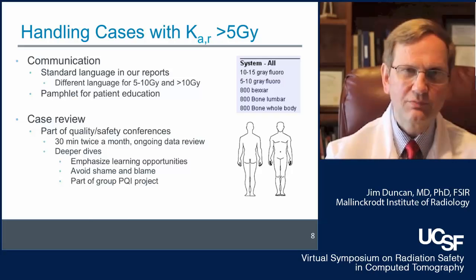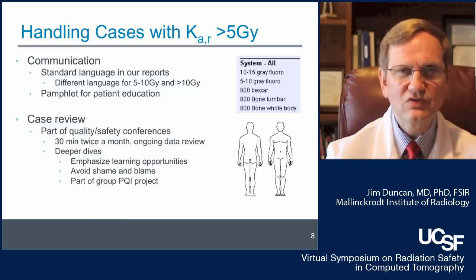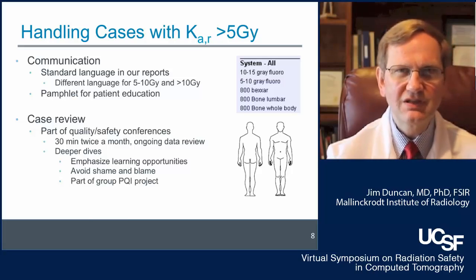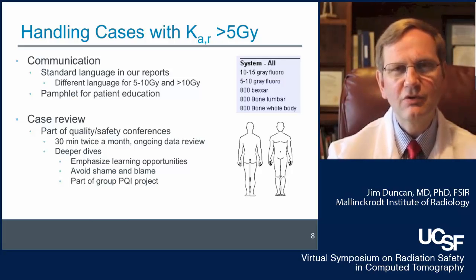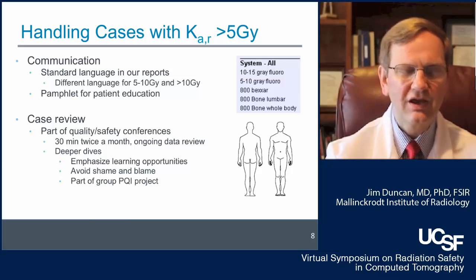And the problem is since most of these skin entry points are going to be on the patient's back, it's really difficult for the patient themselves to monitor it, but rather to point out to someone else that can look at their back, looking for typically a rectangular area of erythema early on for a potential skin injury.